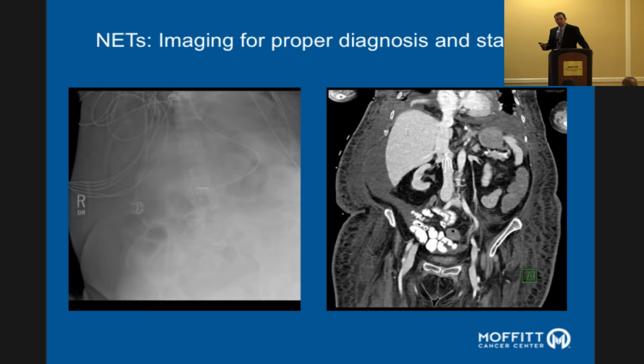So why do we use CT scan instead of radiographs? The amount of information you get is much greater, and multiple studies have shown that even though CT scans expose our population to medical radiation, we gain tremendous benefits in all areas of medical care from this technology. Whether you're talking about emergency medicine, there was a time when, if they thought you had appendicitis, the way they verified that was they cut you open. Now, if they think you have appendicitis, they do a CT scan.